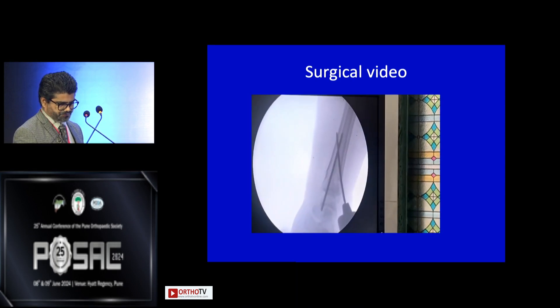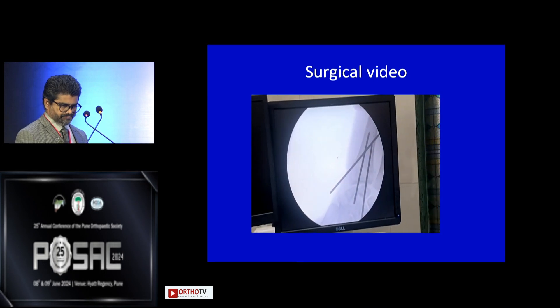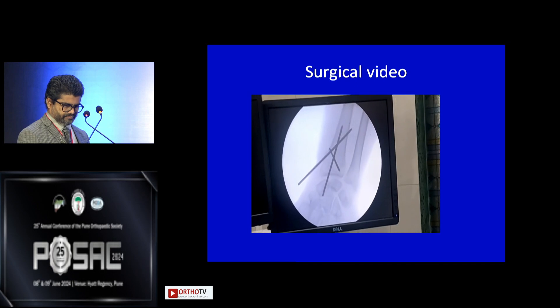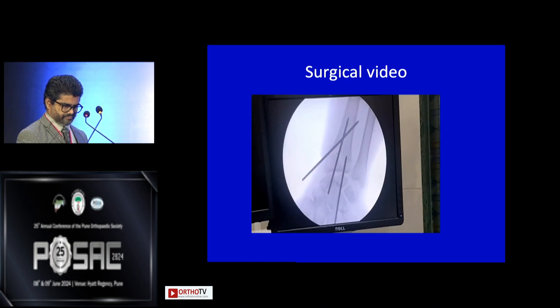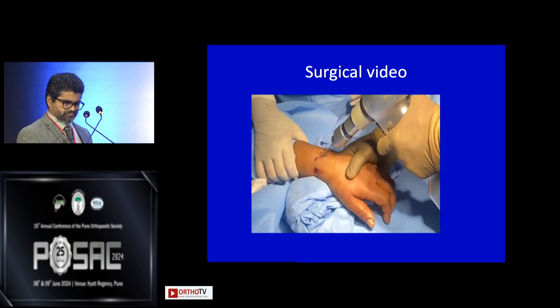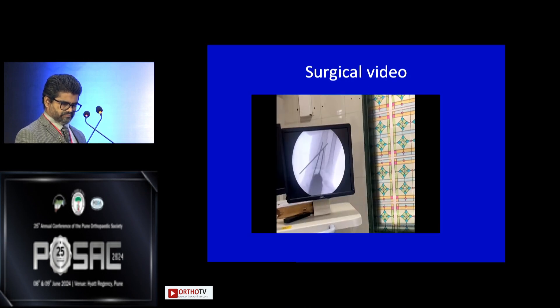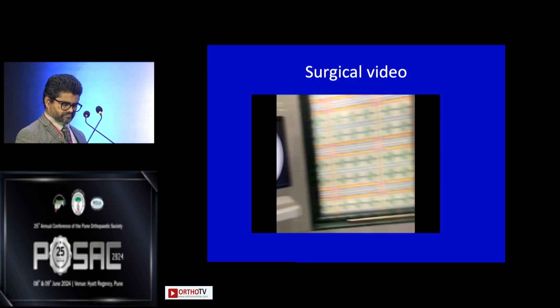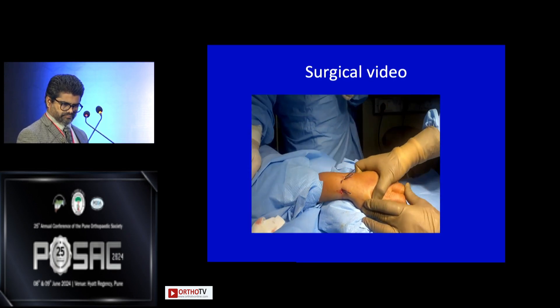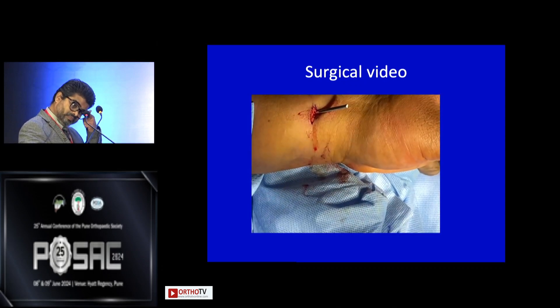The AP view and lateral view are confirmed. A third wire is then passed from the other corner of the radius — the same steps are repeated. We pass the K-wire from the fracture site from 90 degrees to 45 degrees, reduce the ulnar corner, and maintaining the 45-degree angle we drill the far cortex. The X-ray in lateral view shows well reduced alignment.